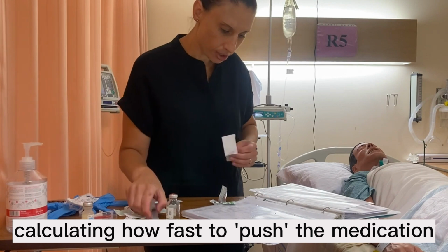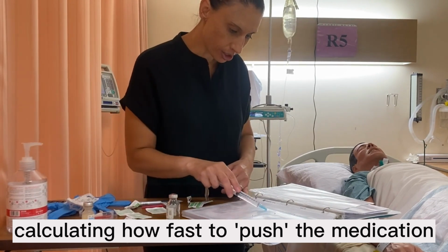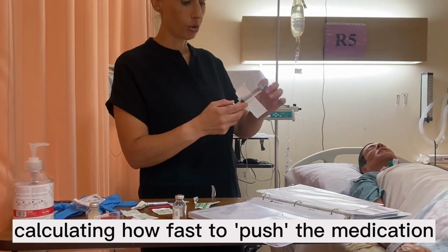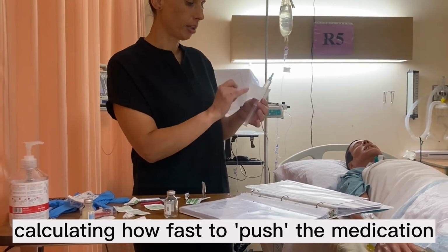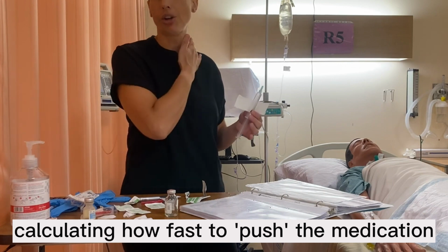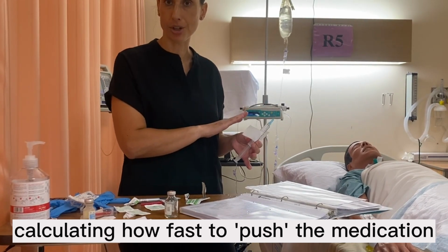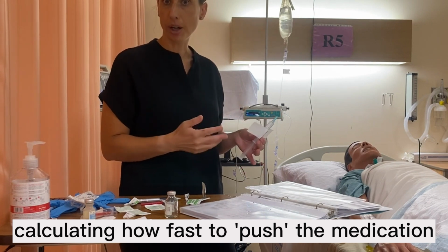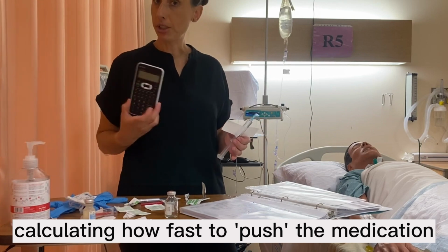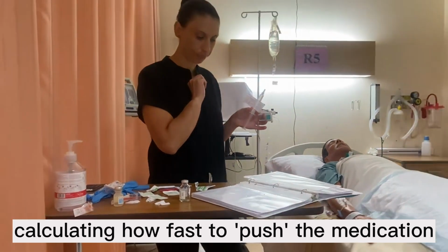Also important to notice as well, how fast can I give this? So we're gonna take a look at over 3 to 5 minutes. So we're gonna have to do a bit of a calculation there. So I calculated I have 10 mLs. I'm gonna give it over 5 minutes. Because this patient has not had this medication before, I'm gonna give it nice and slow so I can watch for any reactions. If they had this medication before, I might wanna give it a bit faster, over 3 minutes. So it's completely up to you.